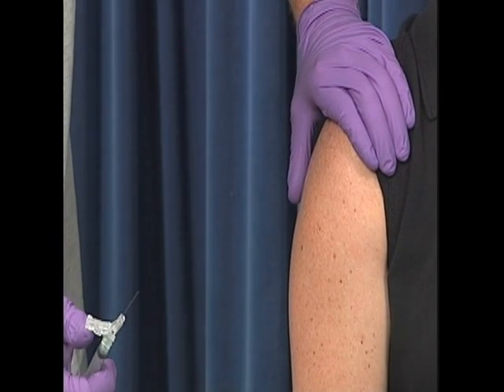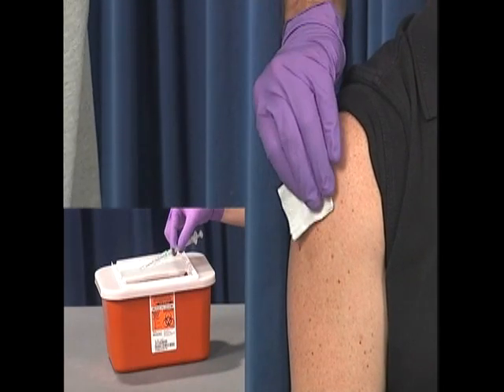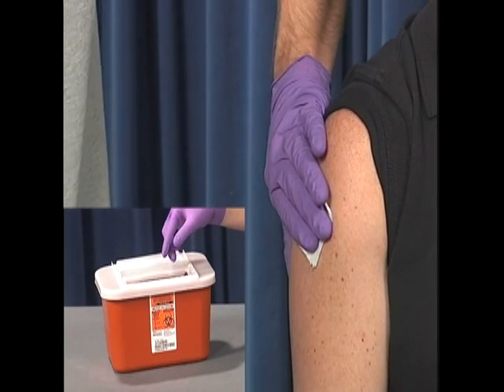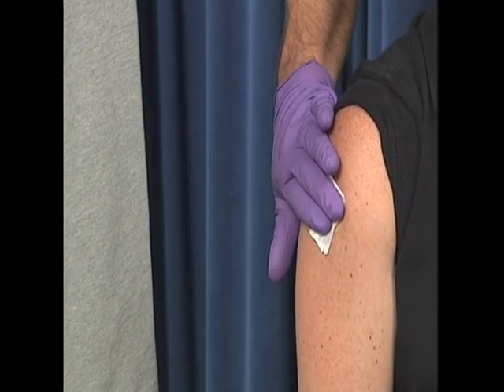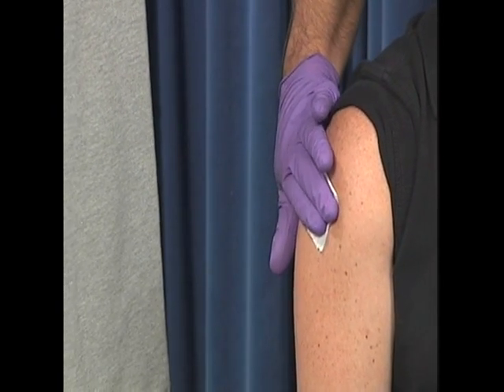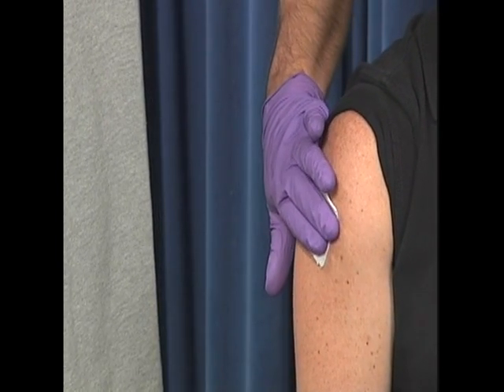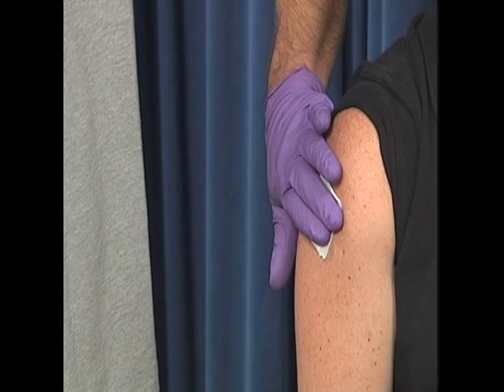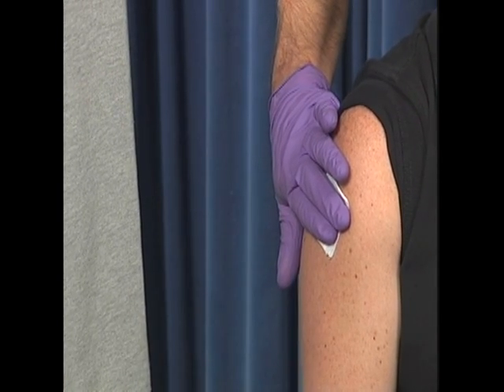Once the medication has been administered, withdraw the needle using the appropriate safety features and properly dispose of the syringe and needle assembly in an appropriate sharps container. Cover the injection site with an alcohol or gauze pad and apply gentle pressure to the area to help reduce the pain and improve absorption. Apply a bandage over the injection site.